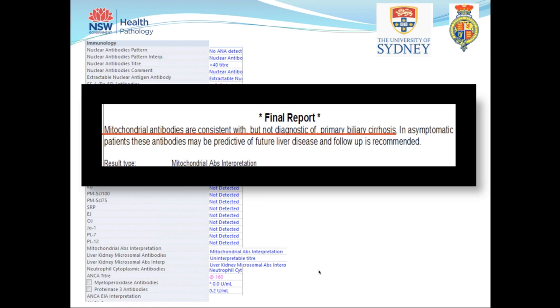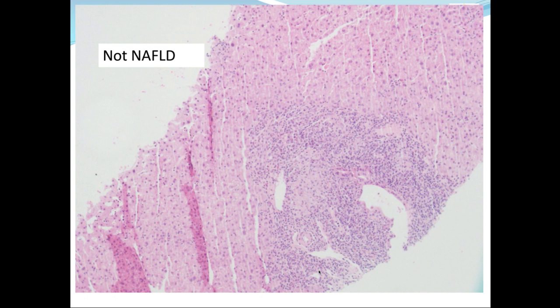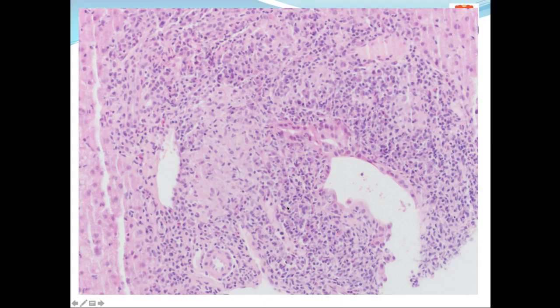It is important, I think, to note that these antibodies can predict future liver disease in patients if they're picked up on screening. So in terms of those 3 potential etiologies, we can immediately rule out non-alcoholic fatty liver disease with the complete absence of fat. But what I'm sure you can appreciate at lower power here is these portal-based granulomas, shown more closely here with some quite obvious duct damage.